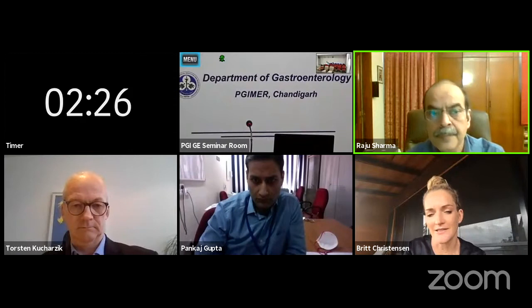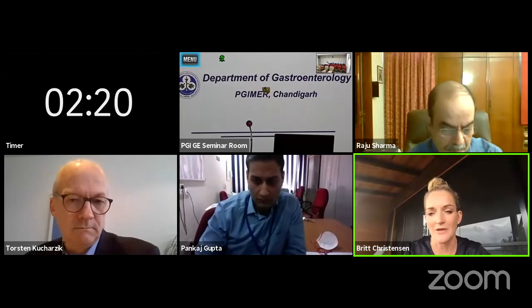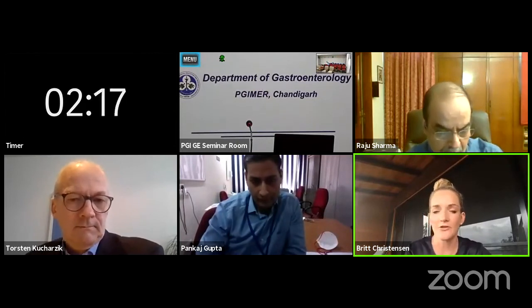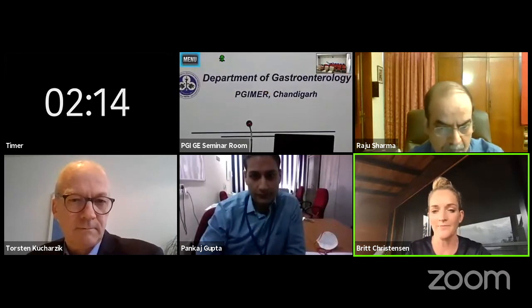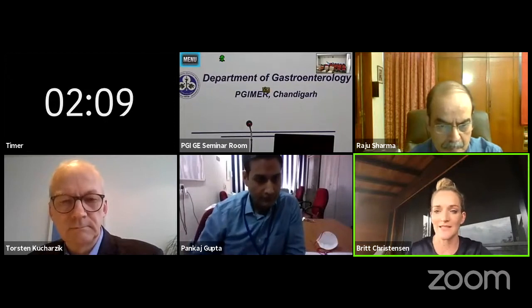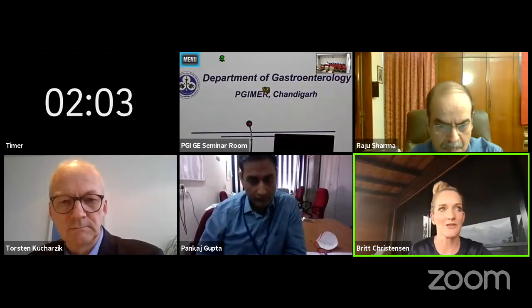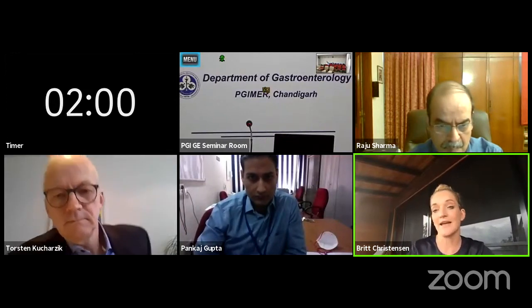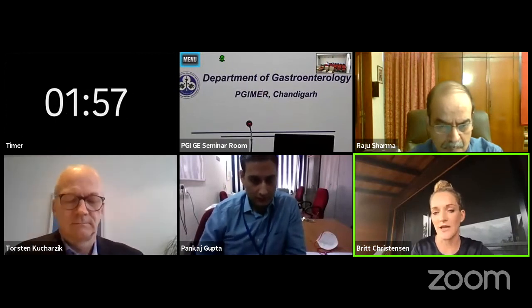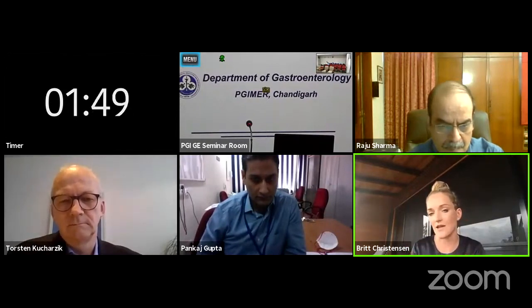Awesome. I'll just add to that, I totally agree with what Torsten said, it's adding another tool to our armamentarium on how we can monitor the disease. So if I have a new diagnosis patient, I will still do my MRE and then I'll make sure my ultrasound aligns. And then I can discard the MRI. I don't need to keep doing them every time I see the patient or every year, unless it doesn't make sense. So if eventually they're showing symptoms or something's going on, and this is not fitting with the ultrasound, I may then go, okay, maybe I need an MRI again in that situation. But that yearly MRE to follow the patient, you don't need to do anymore, because if that first MRI and ultrasound align, the ultrasound is perfect to monitor those patients.